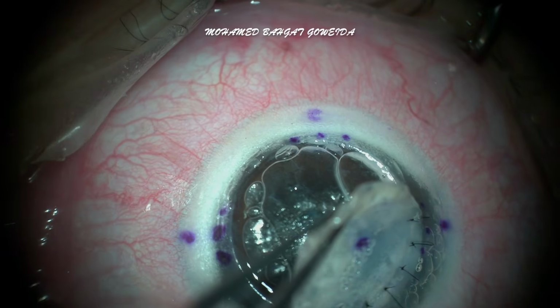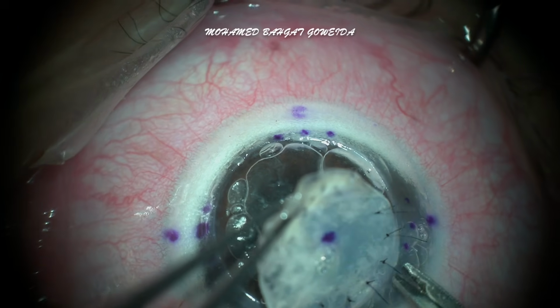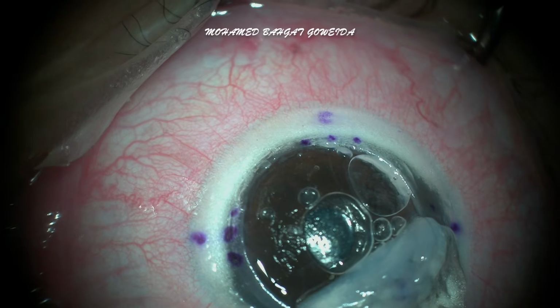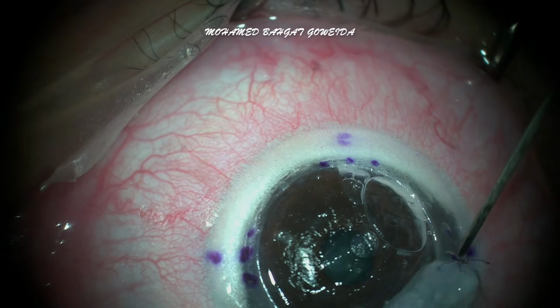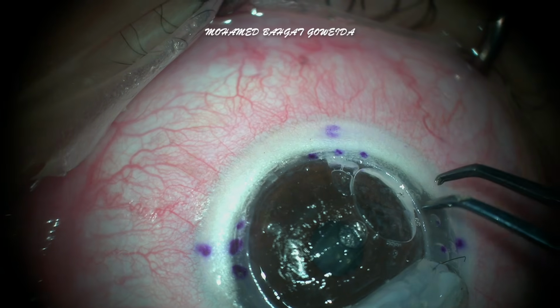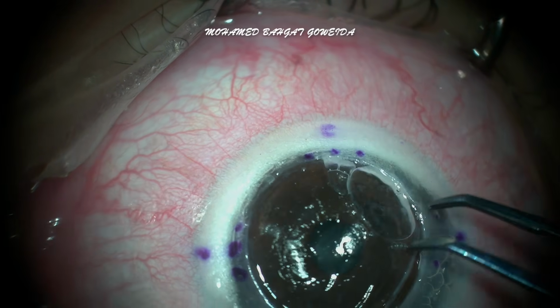Sutures are then removed to continue dissection in the superior quadrant. The perforated area is dissected by gentle peeling of the stroma from Descemet membrane. Blunt dissection is difficult in the area of perforation as it will result in collapse of the AC and possible extension of Descemet membrane tear.